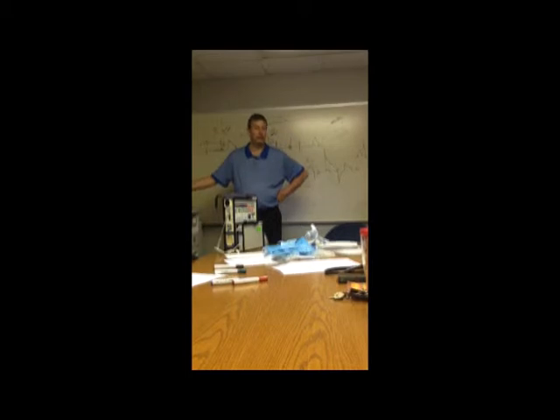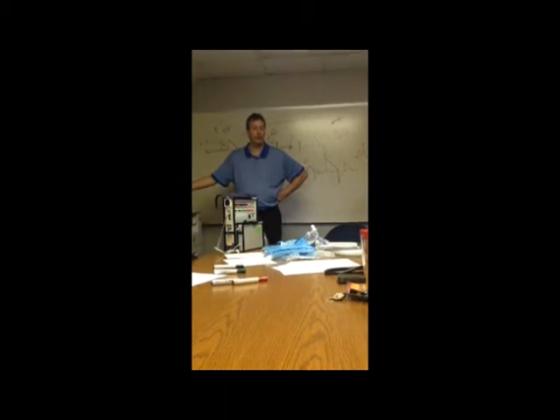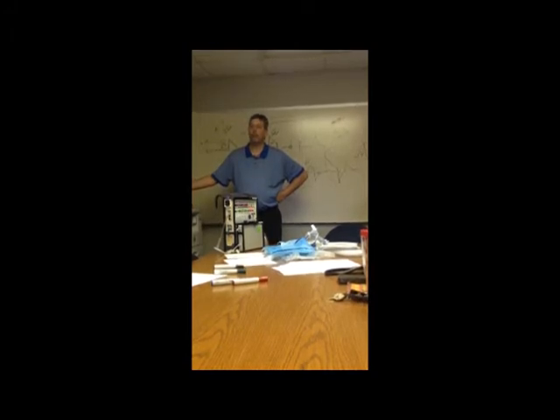So in using that, if you've got an air-hungry patient who's on 16 over 5 and they're still breathing 30 times a minute, start going up on that IPAP. Don't get up into the 20s. I mean, stop at 20, 22, because to be honest, if 20 or 22 ain't working, 25 ain't going to make a difference. And it gets risky. You're getting close to that line.